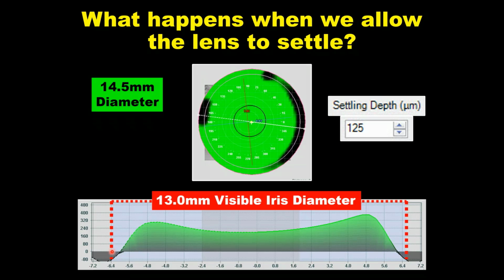So this is a very concerning fit. There's no way we should be fitting a 14.5 millimeter scleral lens on this huge eye. We definitely want a much bigger contact lens.